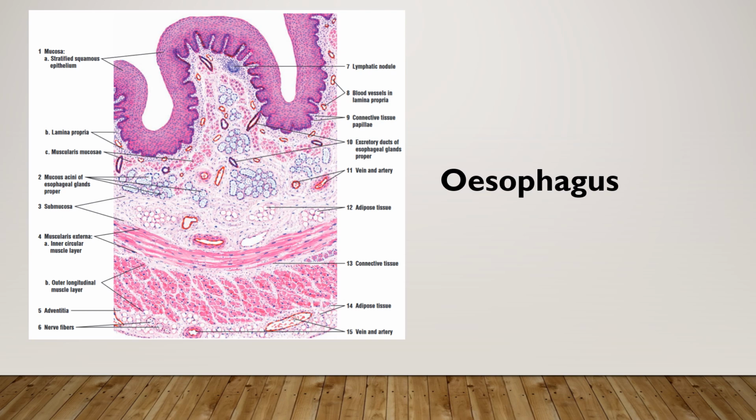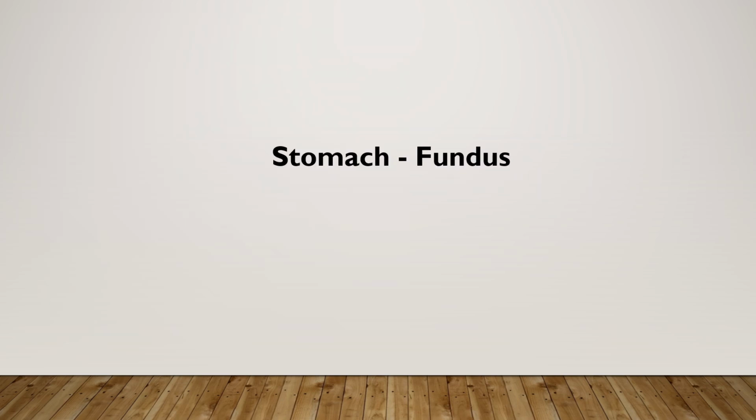Okay, so next we will see about the stomach. Under the stomach, as I told, we have two slides. One is stomach fundus, the other one is stomach pylorus.